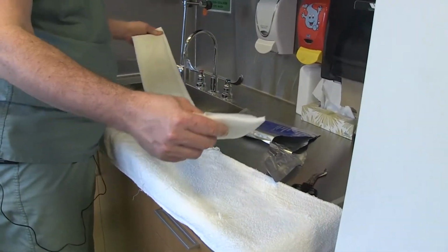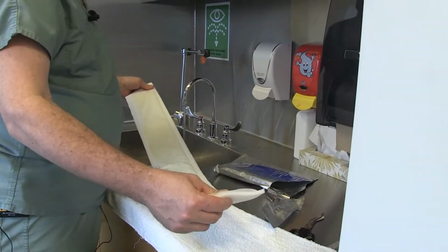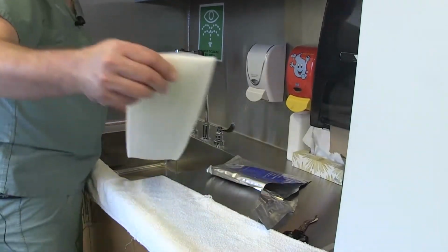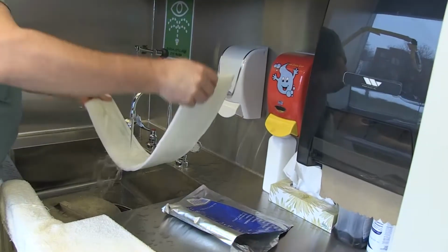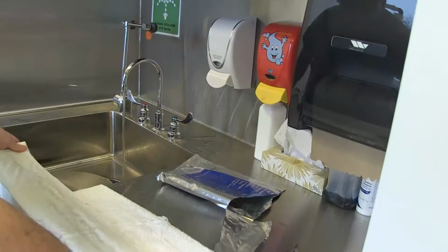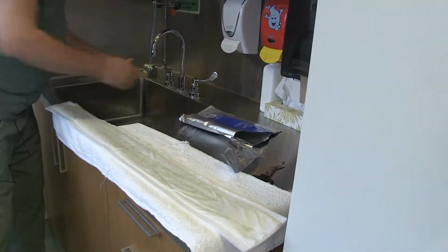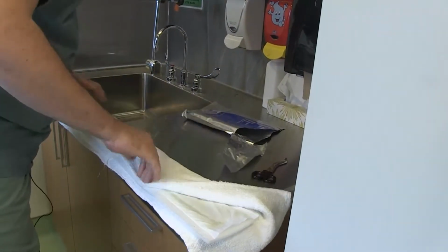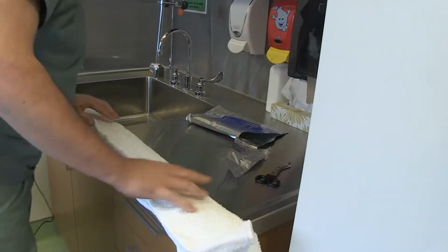This is really important. From the moment we dampen the brace, we have 3 minutes to apply it. It will harden in 3 minutes. So we quickly run it under water like so. No need to take much time here. The minute there is a bit of water in it, like so, the chemical reaction has started. So what we do is we remove the excess water so the patient is not so soaked.